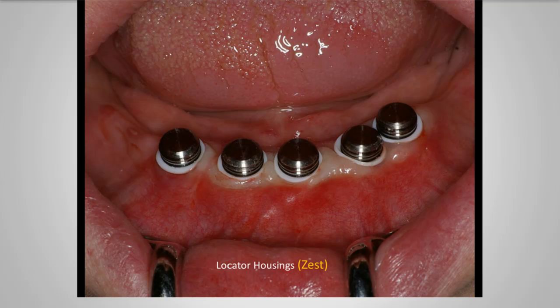Well, one is the Thompson sticks, where you wet the stick and it leaves an indelible blue ink on the housing, and we try to seat the denture and we see where it marks the denture and we relieve it. Another thing that I've used that comes in the Quick Up kit is the Crown and Bridge fit test.